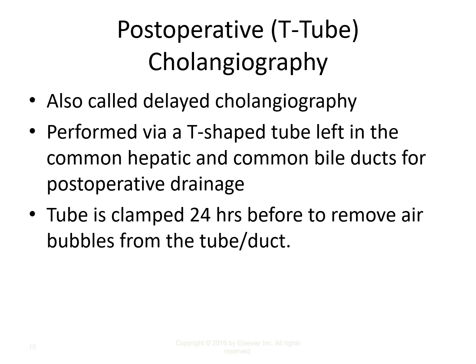The stem of that drain tube cannulates the remains of the cystic duct, and then the T goes up into the common hepatic duct, and also down into the common bile duct. And that T tube promotes drainage of the biliary system in the event the patient still has stones to pass.